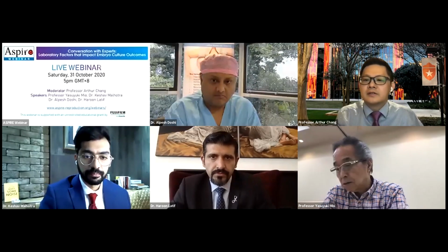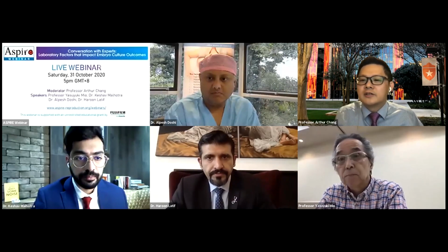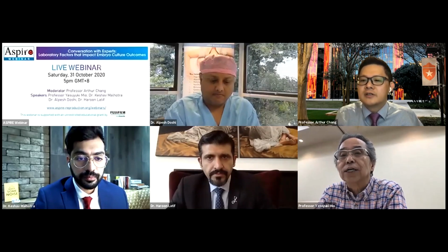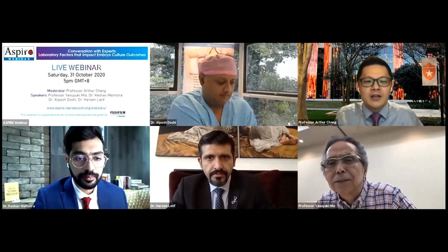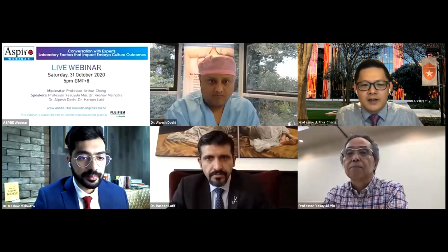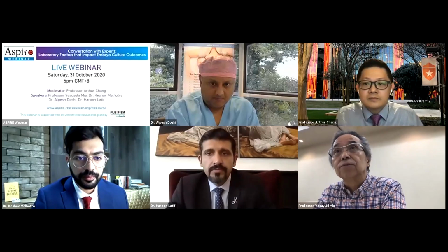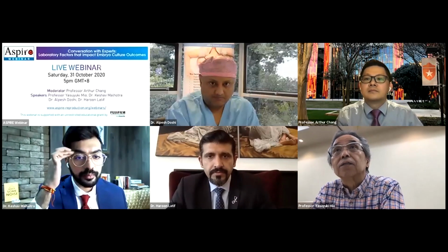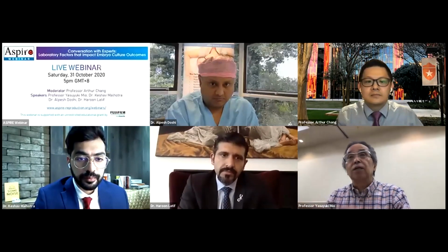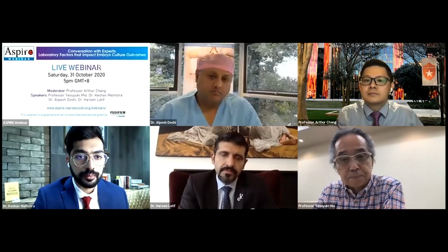Yes. So that also answers the second question from the audience, about changing the medium on day 3. And could you go to day 5? What's your recommendation? Day 3 or just go to day 5? Yeah, I think you should change the culture media around day 3. It's to avoid the effects of osmolality rise.